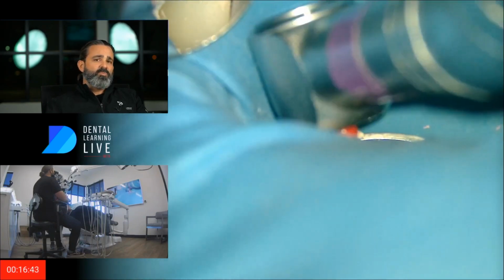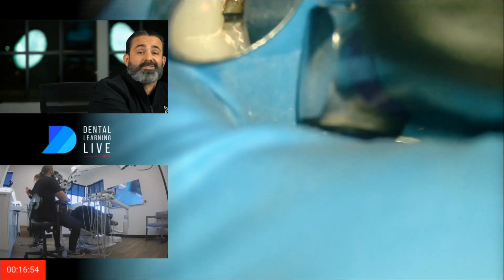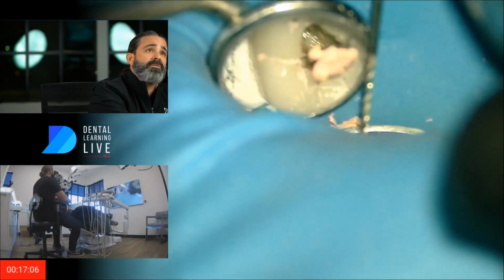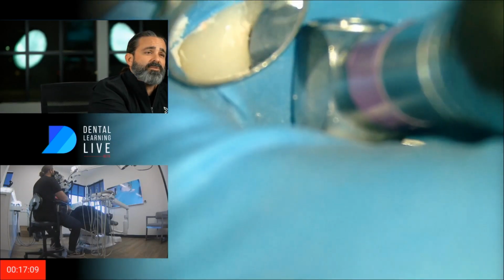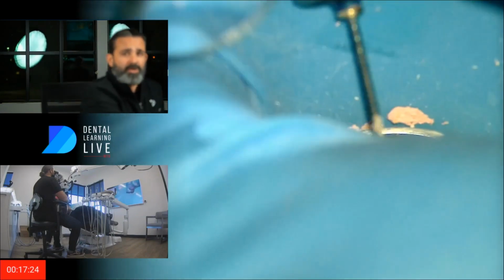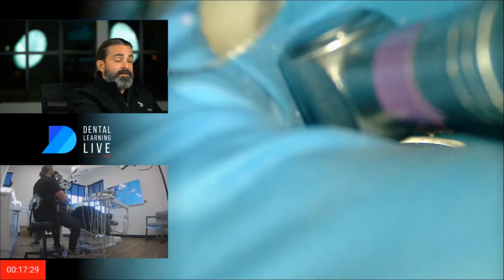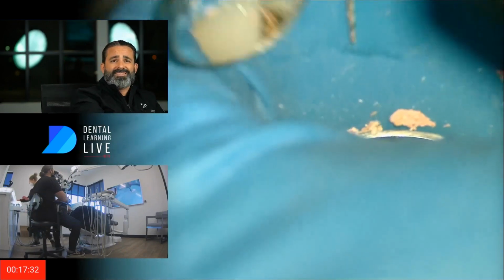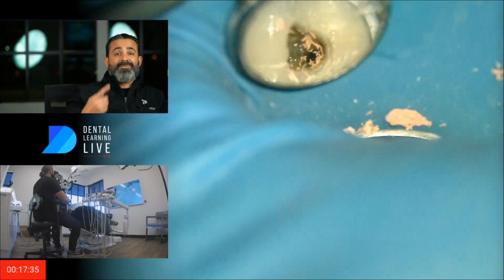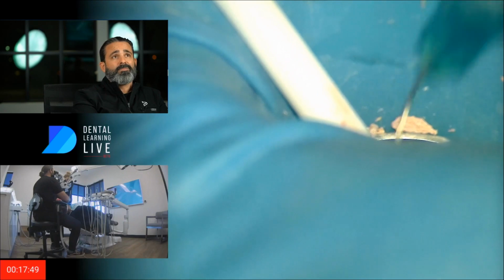Now I'm using smaller tapered files than the canal prep itself. This for sure was an 06 or greater shape. I'm using 04 files now, and just apply, clean, repeat, apply, clean, repeat, and go through it, flicking these little boogers out. And there's a lot of files to do that with. You can always go to larger files if necessary, if you have something that's being stubborn and stuck on the wall, which I'm going to show you, I did have that problem. But I'm going to stay true to the calling.